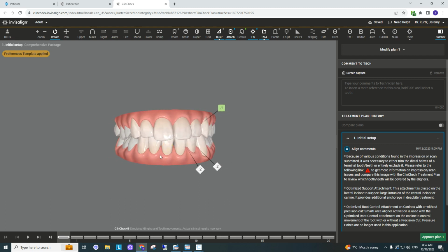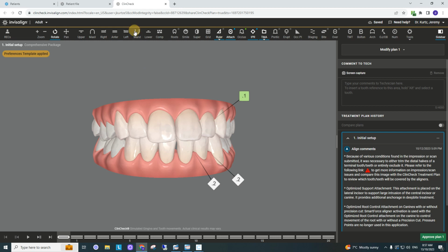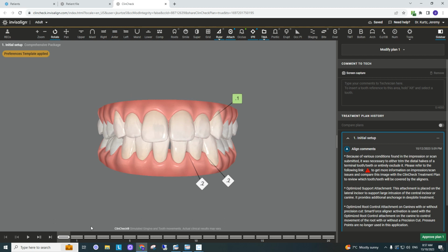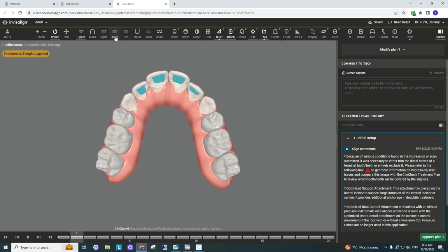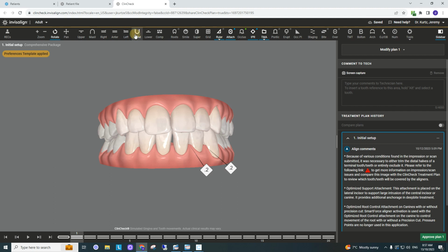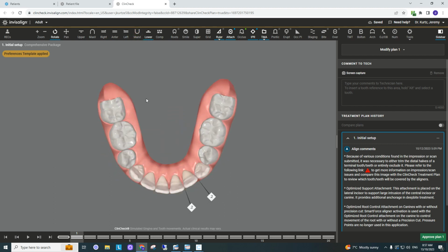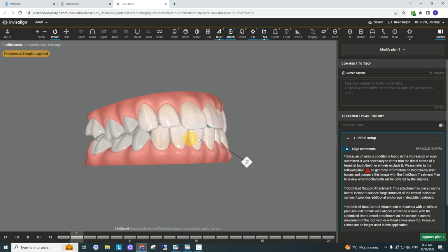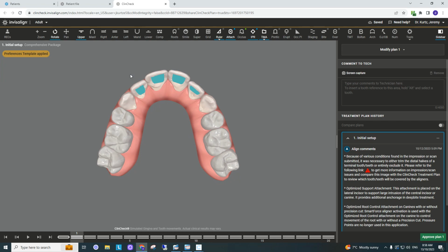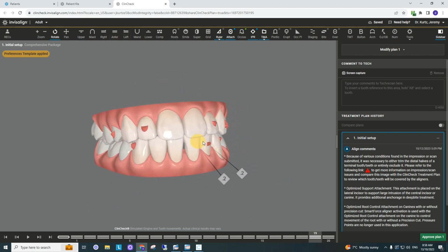So this is one of mine, and it's not a difficult case, relatively straightforward, but I asked them to move anterior teeth only. It was a little bit of relapse. And so let's have a look and sort of see what they did and what changes that I would make, which would be similar to the things that I would show you. So anterior movement only, there was a little bit of crowding. I'd taken off a wire on the bottom where there's a bit of a black triangle, which we'll address momentarily. And then there was a wire on the front two teeth, which allowed them to shift a little bit more forward. So ultimately my goal is to obviously align them better. And there's also some intrusion that's going on here.